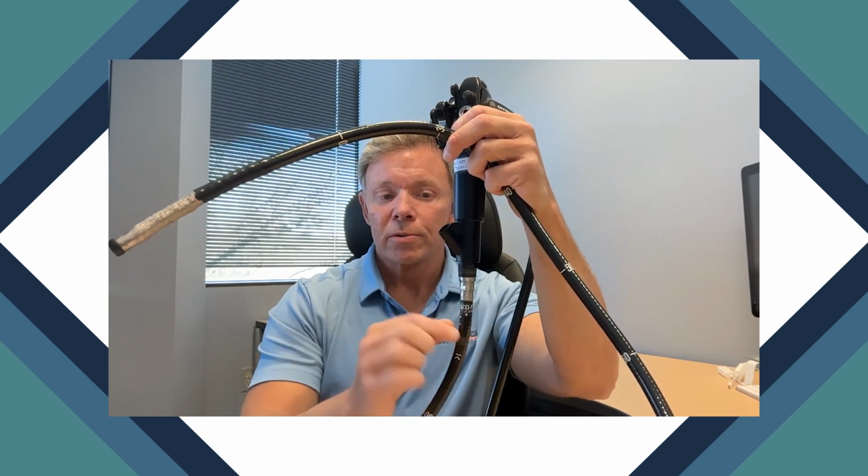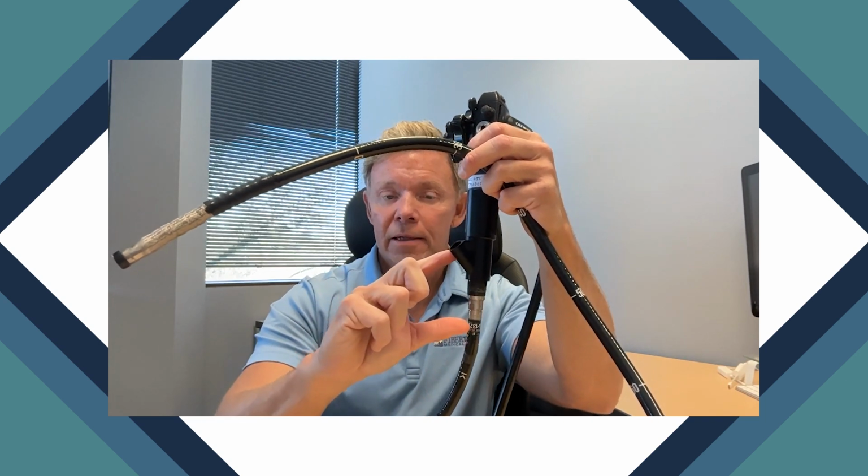We've seen a common area for these tubes to kink is up at the top of the insertion tube, right before it leads into the body, because during a procedure, the physician is holding the control handle up here, manipulating the knobs with his hand, but he's also maneuvering the scope back and forth, trying to navigate it through the colon. And as this is occurring, it's putting a lot of pressure on the insertion tube right here before it connects into this control body.